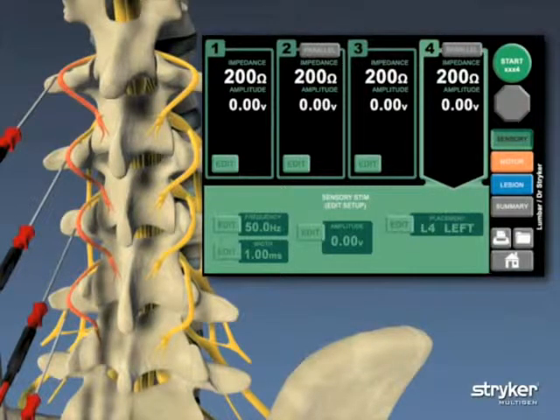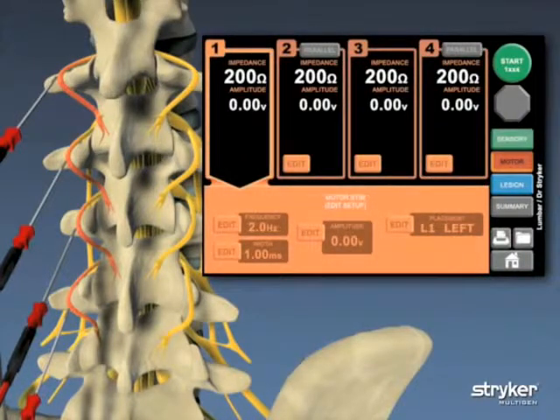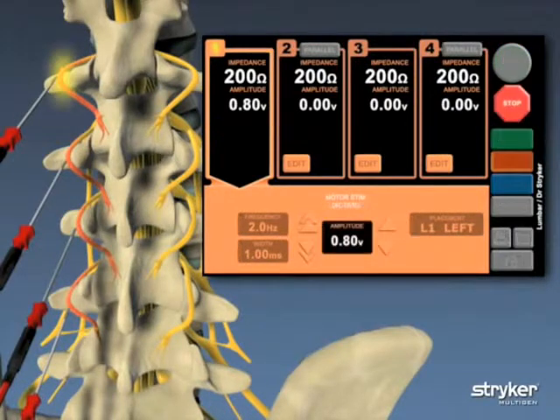After the sensory phase is complete, the motor button is selected and the screen changes from green to orange. The user again has the option to modify the default or saved motor stimulation settings. When setting adjustments are complete, the motor stimulation tests are administered individually at each needle site.